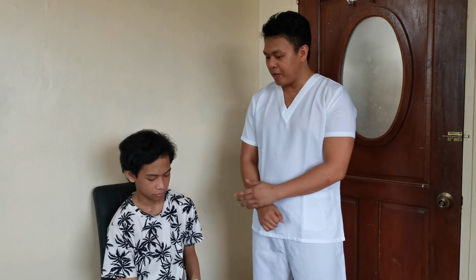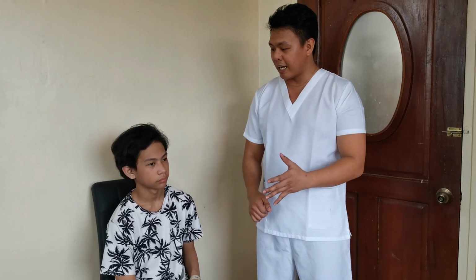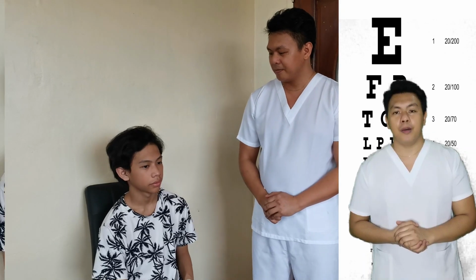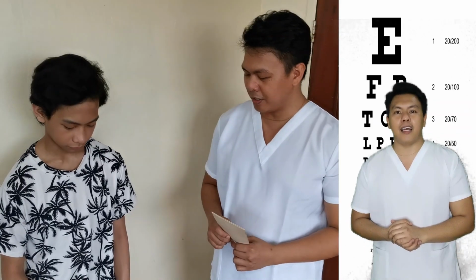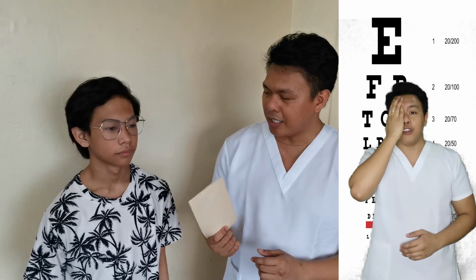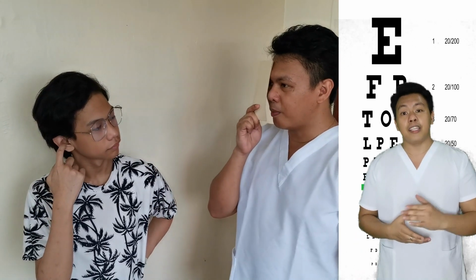Sige. Gamiton nato na siya sir ha, kanang imong salamin nga naigrado unya sa ato ang pag-assess sa imong mata. Suoton na nimo siya. Sige. Number 8. Have the client stand 20 feet or 6 meters from the Snellen chart or E-chart. Then cover the eye to be tested and ask the client to read each line until he or she cannot decipher the letter or their direction.